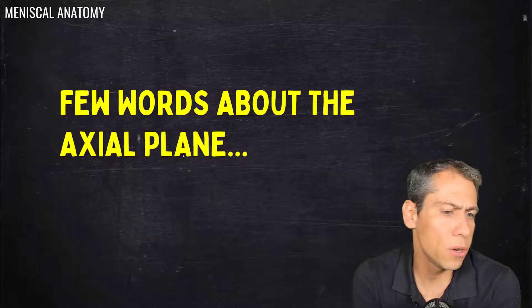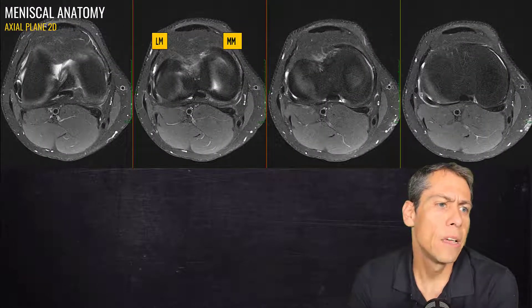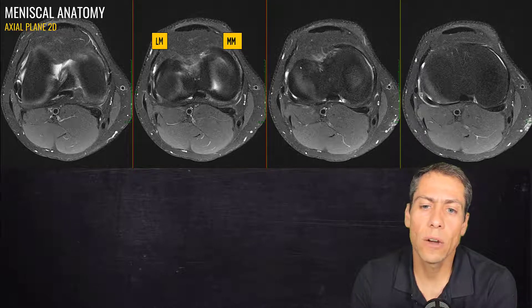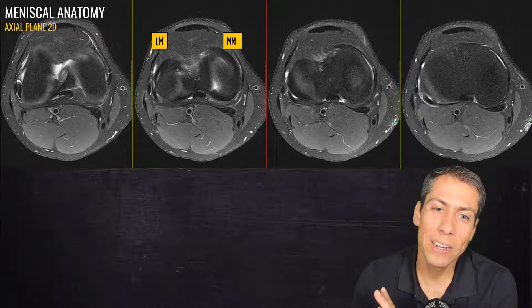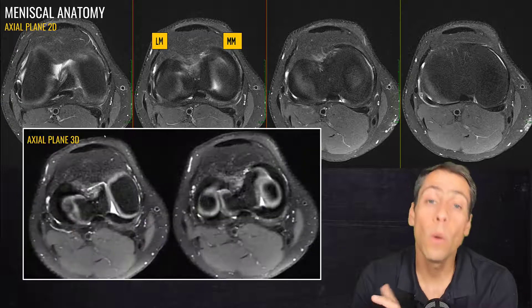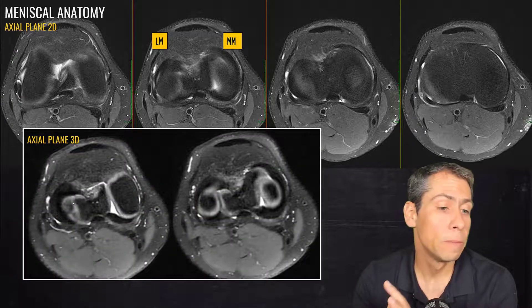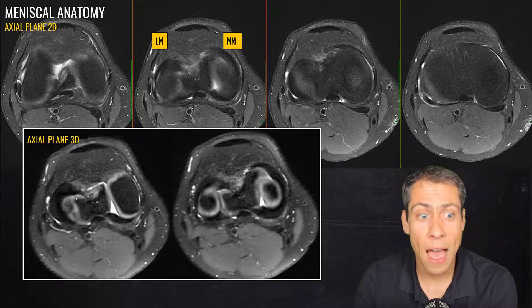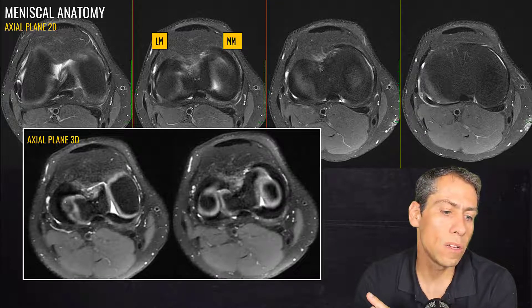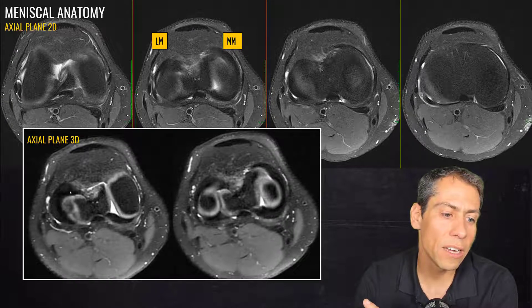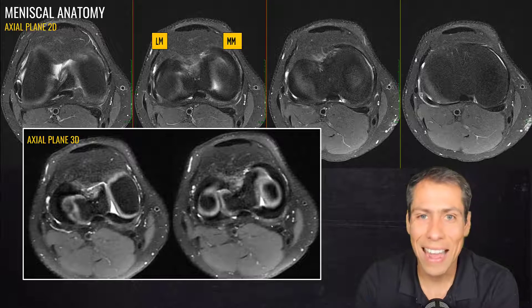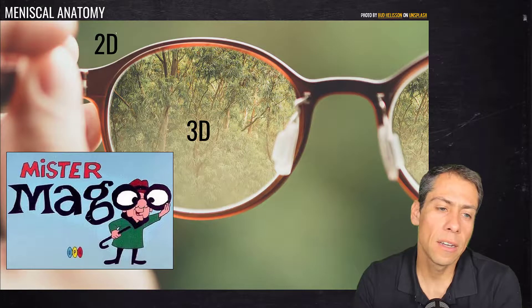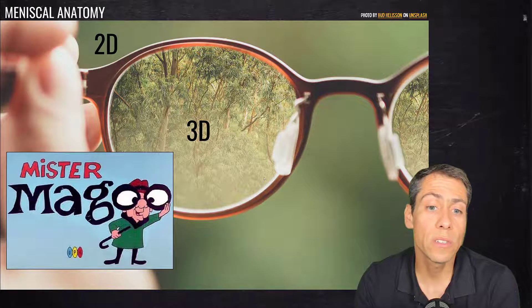Just before we finish, a few words about the axial plane. Here is an axial plane 2D sequence — we can see the lateral meniscus and the medial meniscus. Sometimes it's hard to identify the menisci with high resolution on 2D axial sequences. But now we have 3D sequences, and evaluation of the menisci on the axial plane is much better. Here you can see the lateral meniscus on a reconstructed 3D image in the axial plane, and here is the medial meniscus, including the posterior horn of the medial meniscus on this reconstructed axial plane.